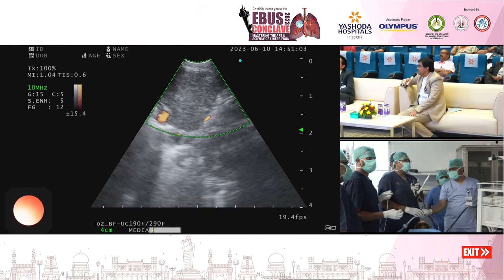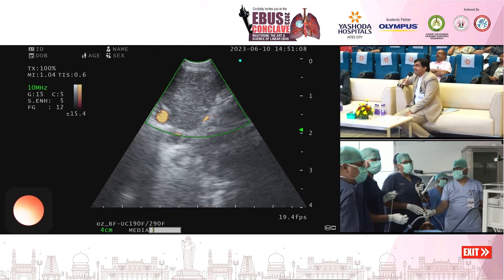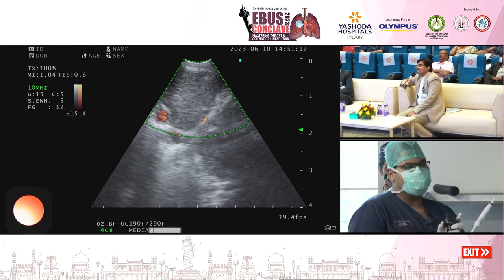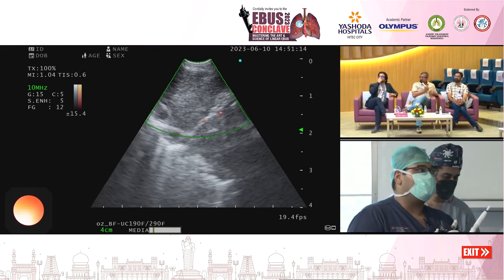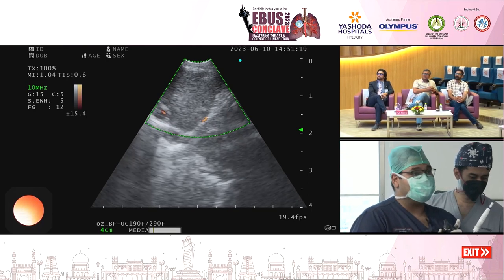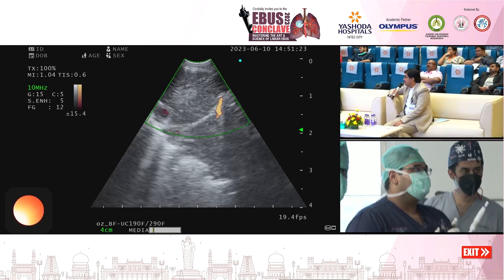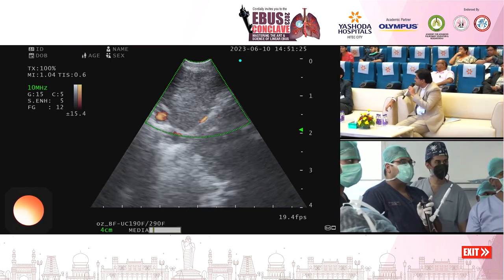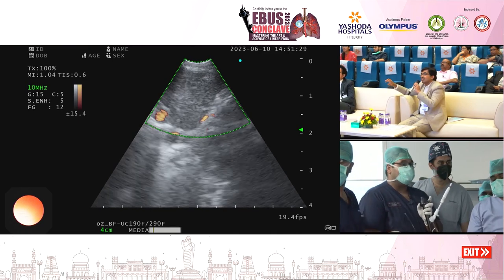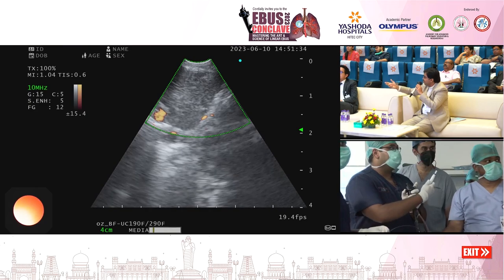Do you always do your EBUS with the Doppler on, or is it just on right now, sir? Sir, I always do it for every pass. For every pass, we recheck. Even if I'm in the same location, as a matter of habit, we recheck before every pass that we are going into the bloodless area. But as Ketan has said, if you try to do the jabs with the Doppler on, it creates a lot of artifacts. Yes, we always remove the Doppler once we have focused on the right area. Exactly. So once you identify the site, you can remove the Doppler and then do the puncture.